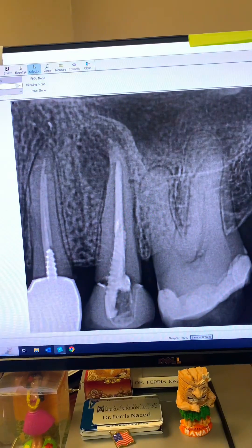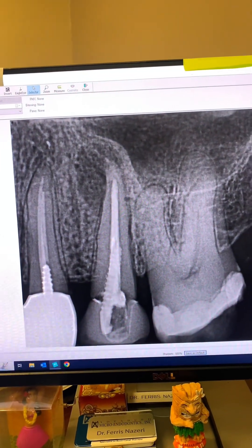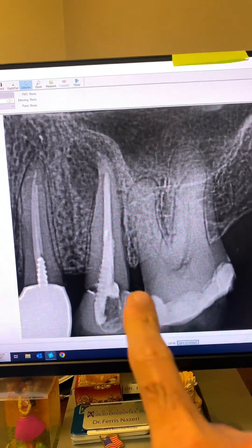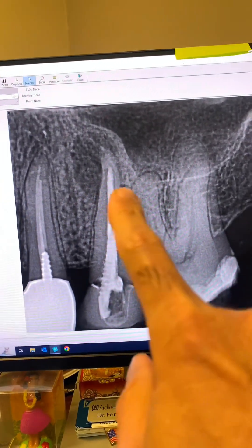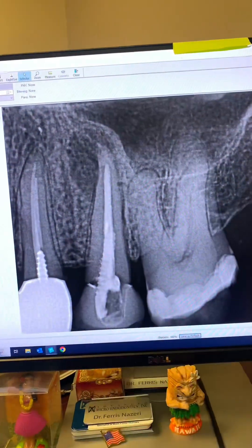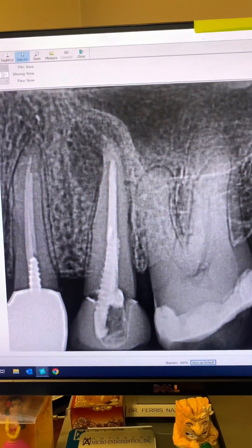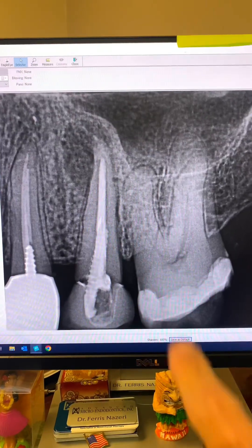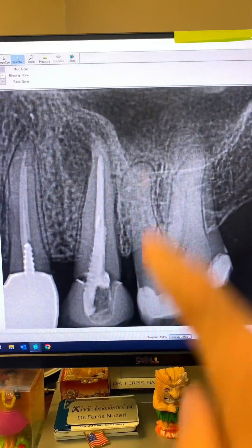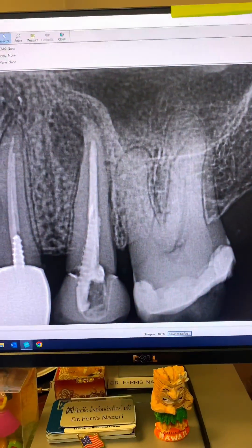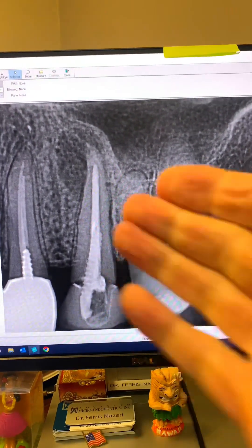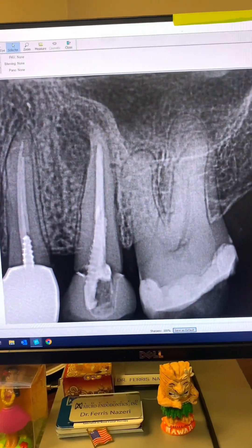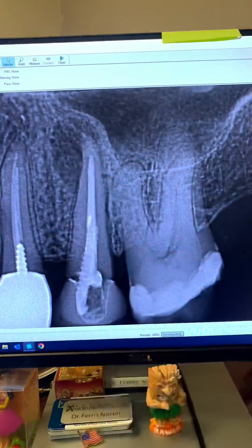And that's why it's so important that every tooth should be probed. Also, before you put a brand new crown on a tooth, make sure you take a PA. This periapical lucency, based on the size of it, I can tell it's been there for a long time. The patient says the crown is about two years old, so whoever did the crown didn't take a PA. If they had taken a PA, they would have been able to see this lucency. Unfortunately, they missed it.